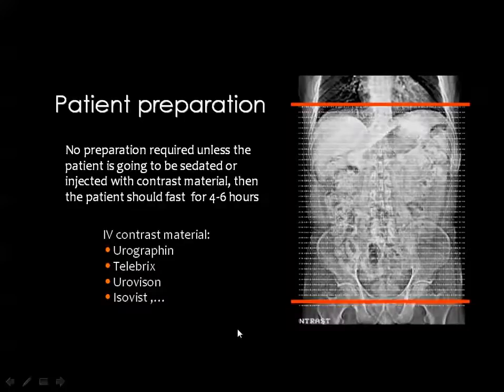And as you all know, we have two types of examination of the abdomen. The first one is the abdominal scan, which is conducted from the level of the diaphragm to the level of the iliac crest, whenever the pathology is confined to the liver, the spleen, or the pancreas. Then the other exam, which is CT of the body, will include also the pelvis in cases where the indications are not clear or the lesion is not reliably localized in a certain area, like diffuse abdominal pain, searching for lymphadenopathy, and searching for abdominal metastatic deposits.